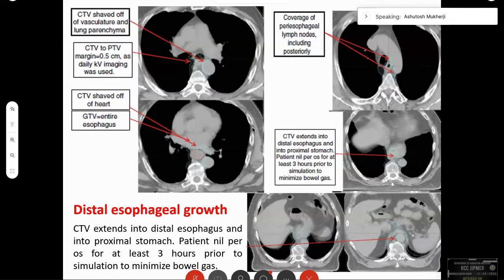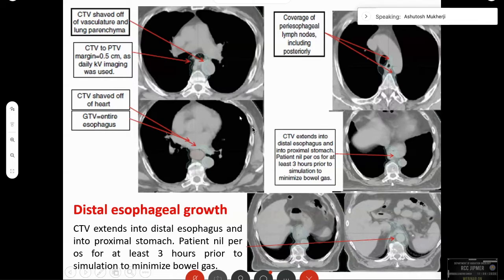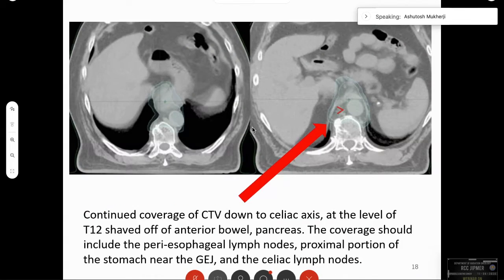The CTV is shaved off the vasculature and lung parenchyma — there is no need to draw full circles around the GTV. The CTV to PTV margin depends on your imaging and delivery protocol. You also shave off the CTV from the heart. The CTV should extend into the distal esophagus and proximal stomach in case of lower esophageal extension. The posterior extent is along the vertebral bone, with parrot-beak-like projections down the side of the bone to include the periesophageal lymphatics.